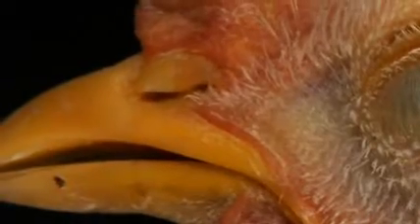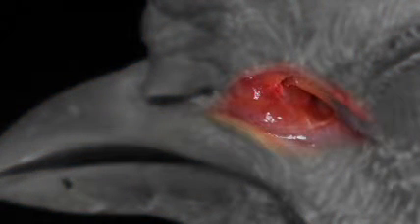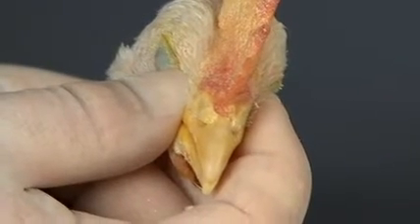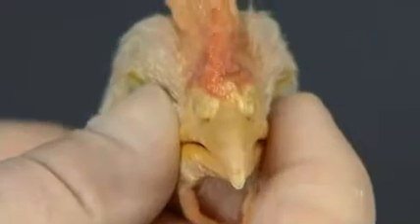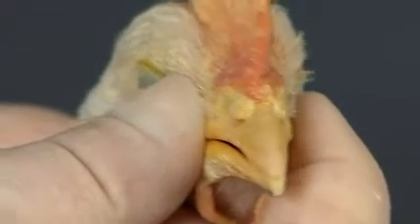The sinuses are triangular-shaped cavities located rostroventral to the eyes. The sinus is normally an air-filled lumen, with one opening into the nasal cavity and the other into the caudal nasal concha. Depress the area over each sinus. If exudate is present in the sinuses, this pressure will force the exudate out the nares or medial canthus. The interior of the sinuses will be evaluated later in the exam.